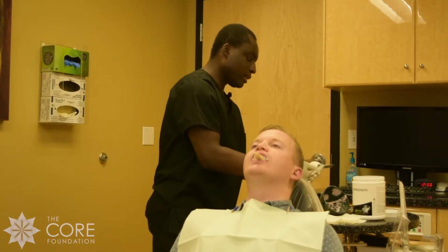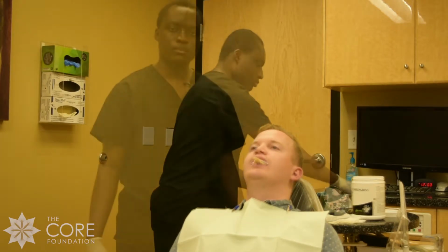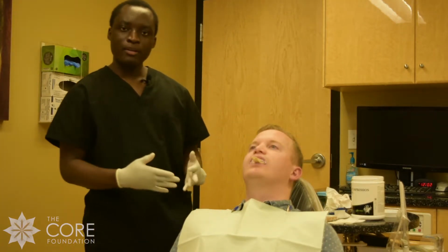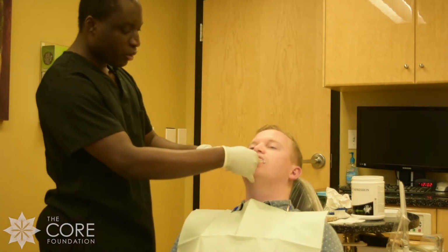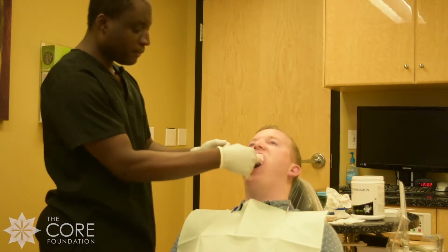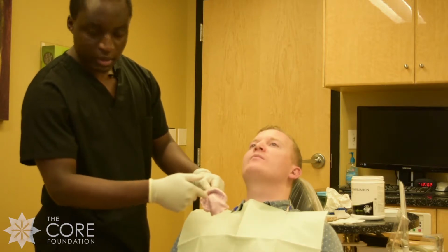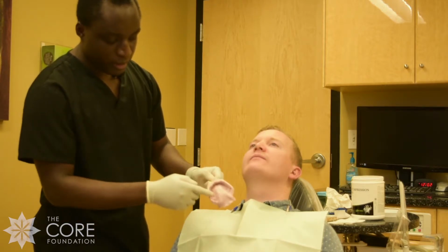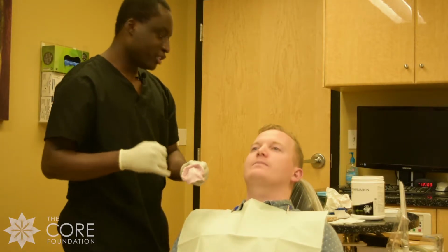We're gonna clean up and get set up for the lower impression. We've waited about 50 seconds, but we're gonna have the patient open. We'll pull it down slowly. And as you can see, we have every tooth covered, and we also have a little nice flap for the ridge of the impression. So this is a really great impression.